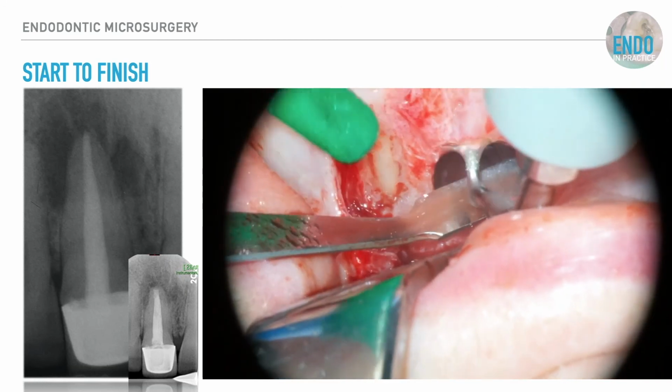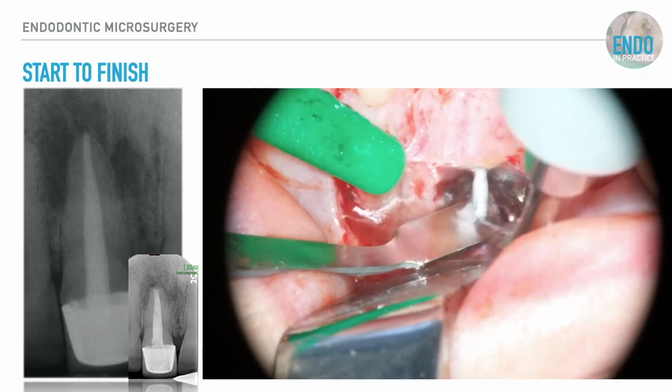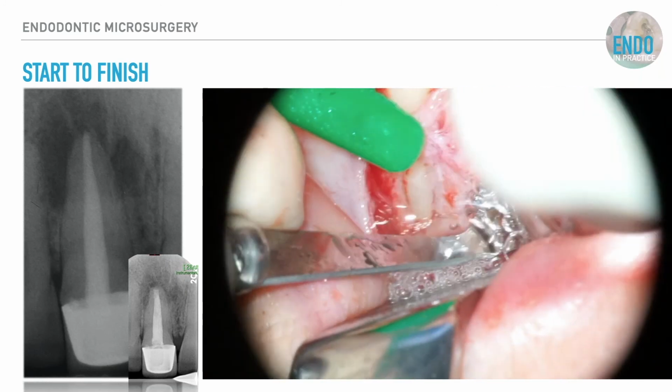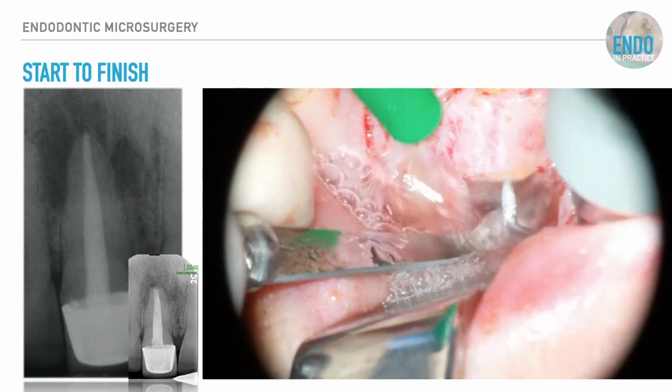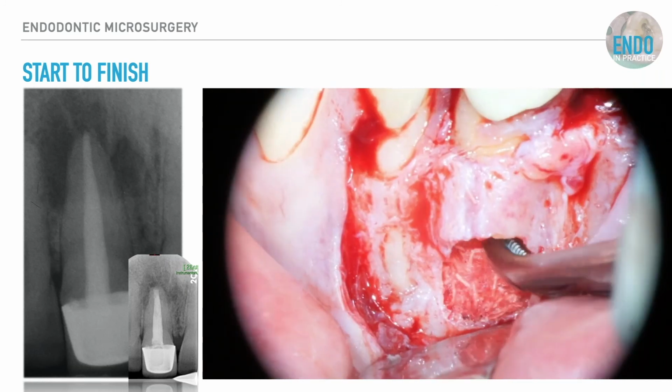The grit on the ultrasonic tip is about 3 millimeters long, and just by gentle pressure, these tips are more efficient at cutting. If you put a lot of pressure on them, they will break. So all you need is access enough to get that in.